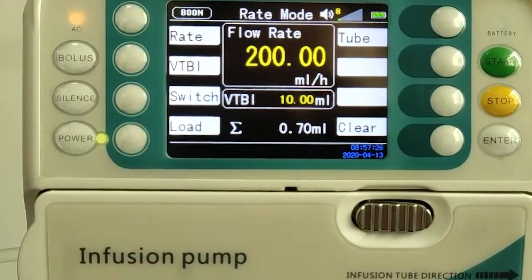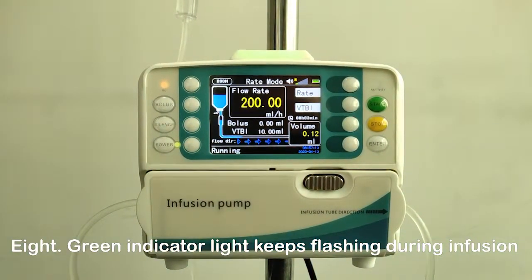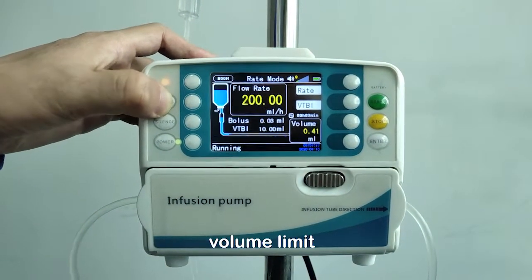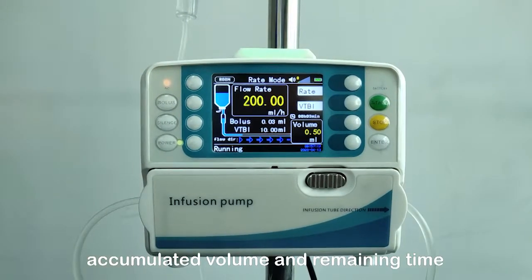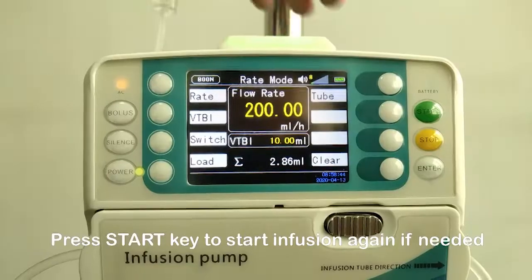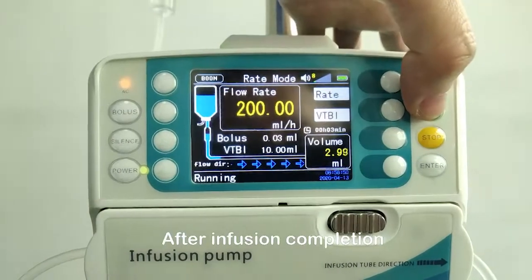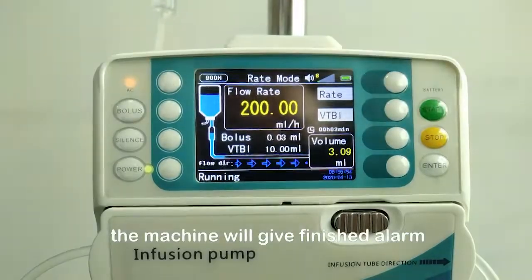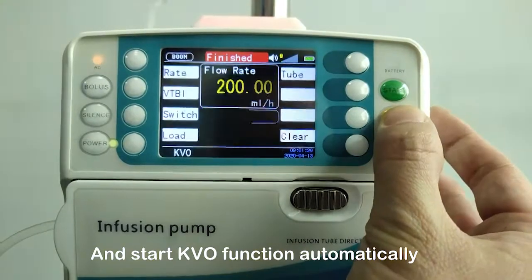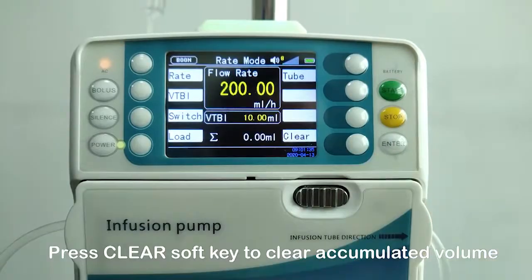Step 8: The green indicator light keeps flashing during infusion. The LCD screen displays information such as flow rate, volume limit, accumulated volume, and remaining time. Press the stop key to stop infusion, or press the start key to resume if needed. After infusion completion, the machine will give an over alarm and start the KVO function automatically. Press the stop key to stop infusion, then press the clear soft key to clear the accumulated volume.